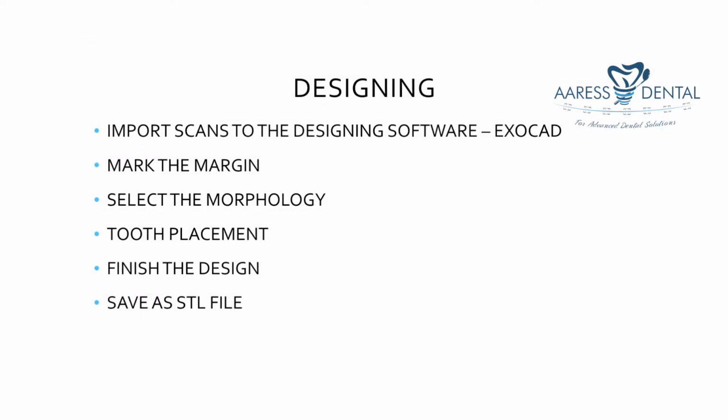Once we are done with the digital impression, we import the scans to the designing software. Here we use Exocad. We mark the margin. We select the morphology of the tooth we want. We place the tooth in the correct position. Then we finish the design and save it as an STL file.